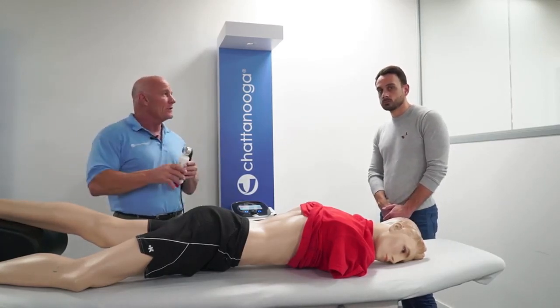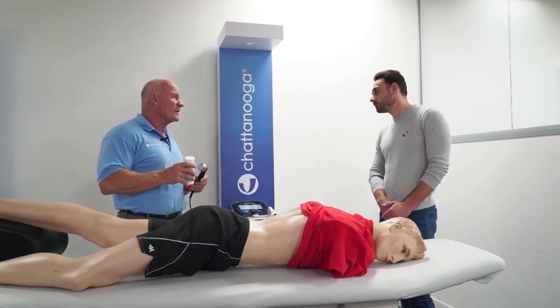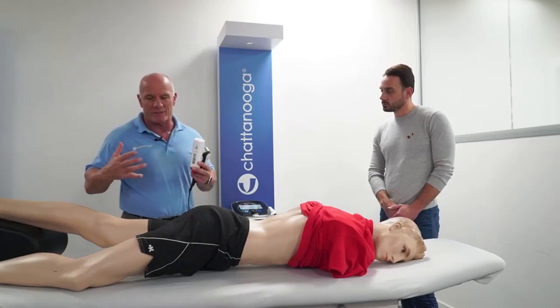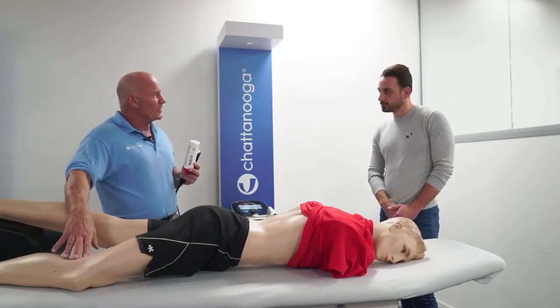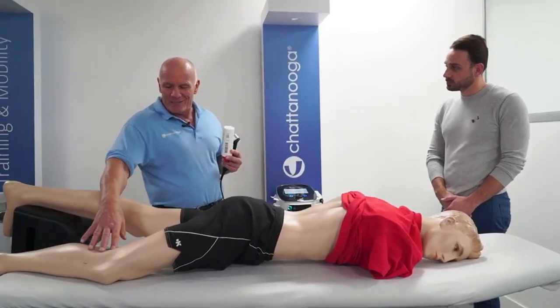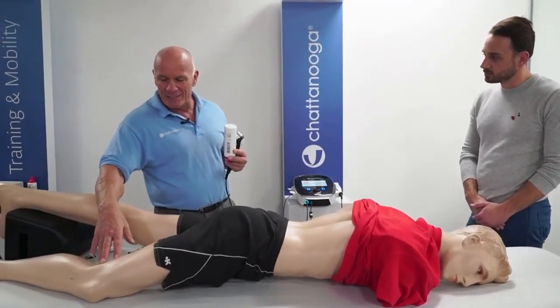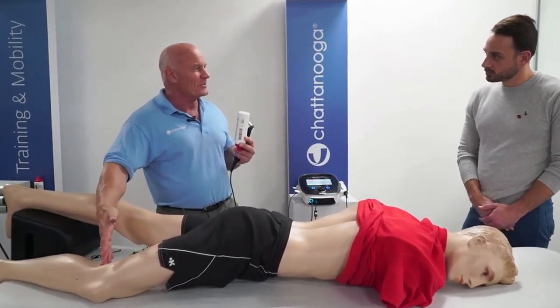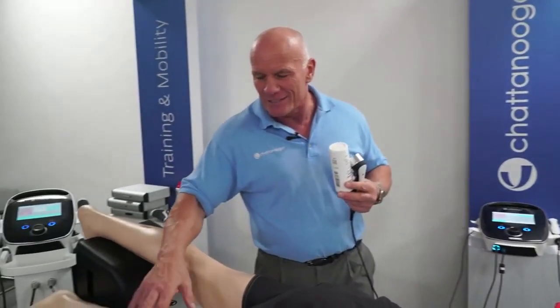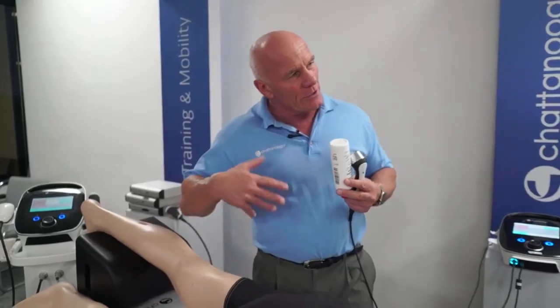Absolutely. And then for a chronic condition, because let's face it, I don't know about you and your clinic, but mine certainly seemed far more chronic. I had a very privileged career in elite sport, so that was a lot of acute stuff, but since going into private practice, a lot more chronic. We use a bit more energy, but less often. Once a week. Okay, great.